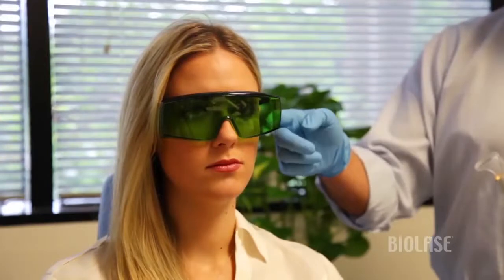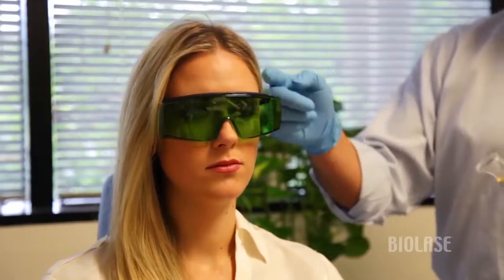Typically when we treat a TMJ case, we'll treat the masseter, we'll treat the joint itself, and we'll treat the temporalis muscle as well — splitting our time between those three areas.